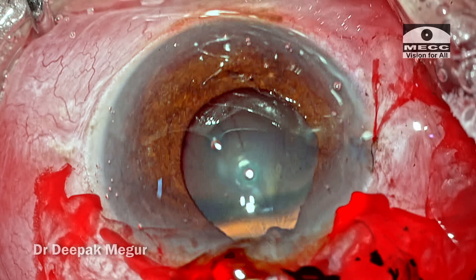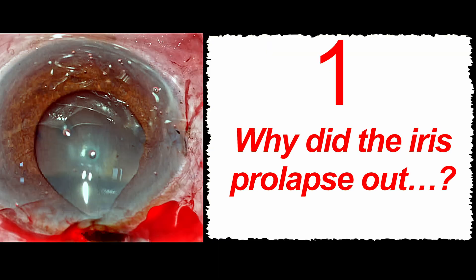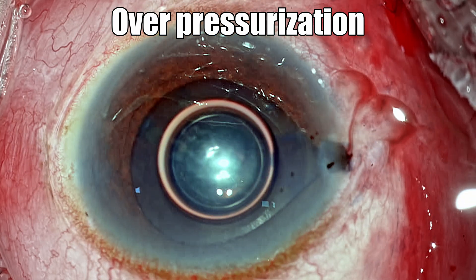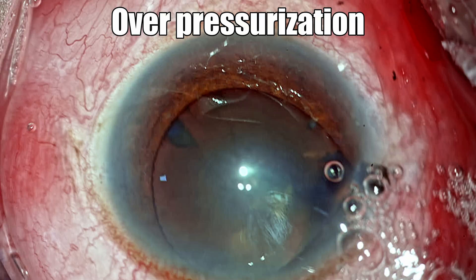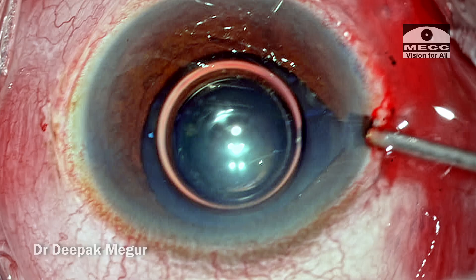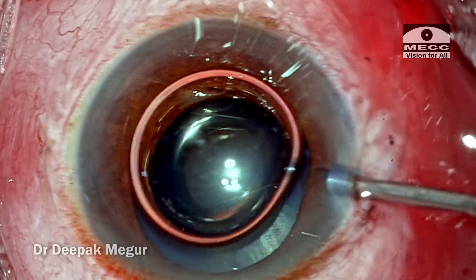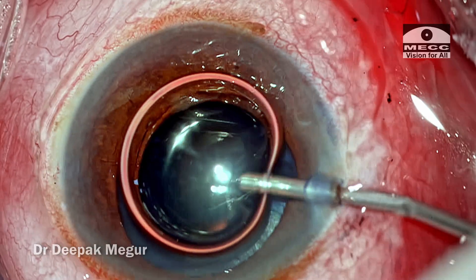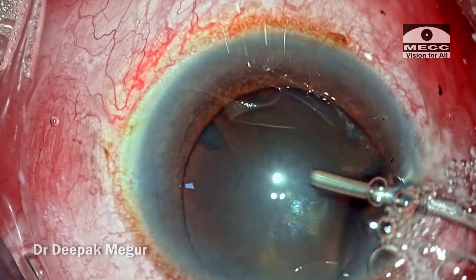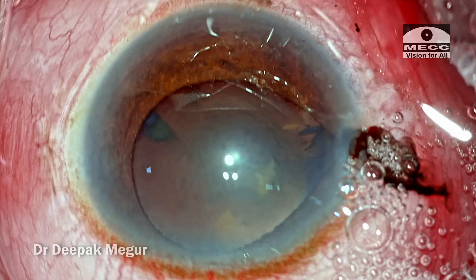I hope you have written down all the necessary points — let us try to analyze this. Number one question: why did the iris prolapse out? The answer is it was primarily because of overpressurizing the chamber. The surgeon is trying to reposition the iris in the same overpressurized state — the pressure in the chamber is still high. It's not going to work. Trying to use OVD again to put into the anterior chamber is again going to raise the pressure.